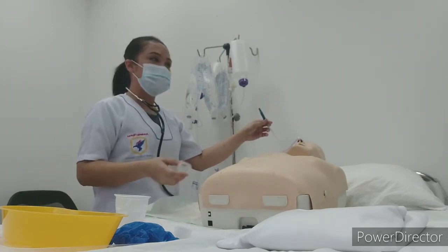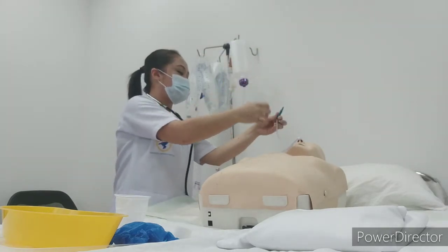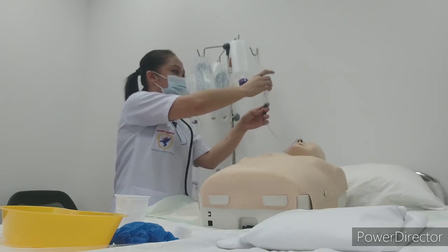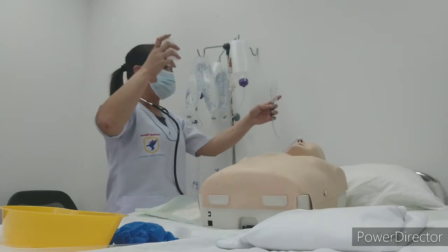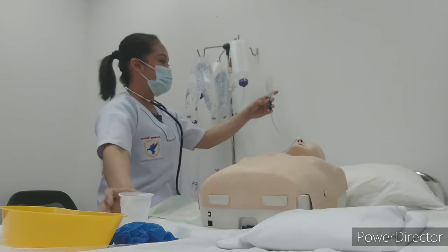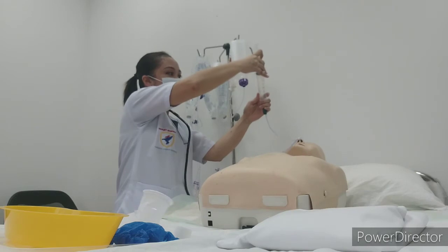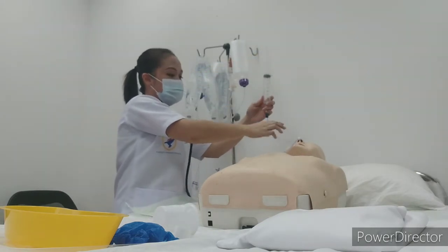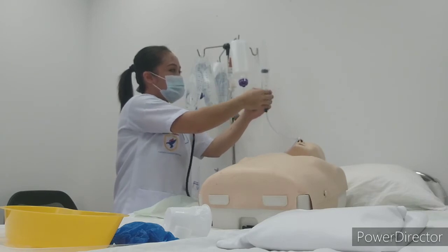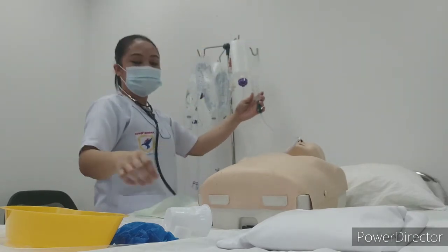So first, we will do the water flushing. We will connect this one here, open and pinch, open, and then connect the syringe. So we will put 30 ml of water. If the water is not going down, take the plunger, and then you will push it gently, until the water is going down inside. So there should be water here until here available. So after that, put this plunger, and then we will start to feed.